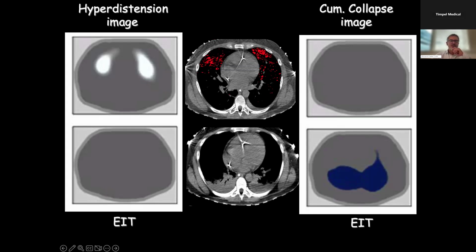And here I think it's nice to observe that even though there's some spatial correlation, EIT is obviously a technique of low resolution in terms of spatial resolution, even though it has a high temporal resolution and can be used for other purposes or other applications that take advantage of this high temporal resolution, such as perfusion, for example.